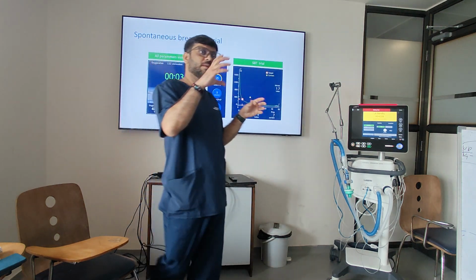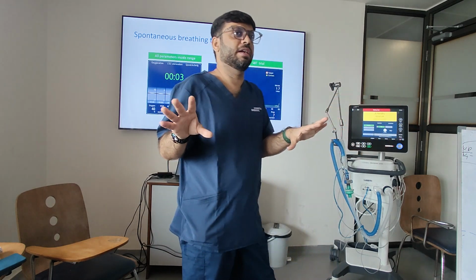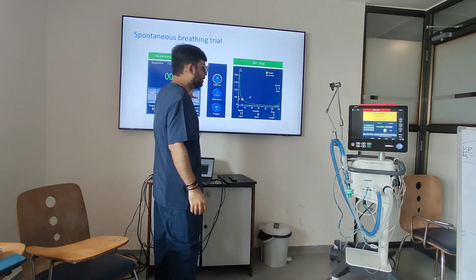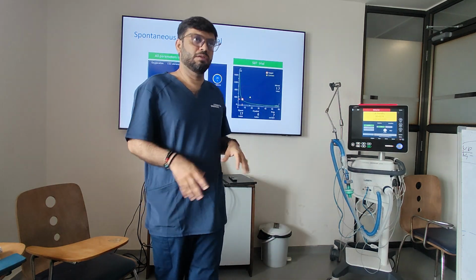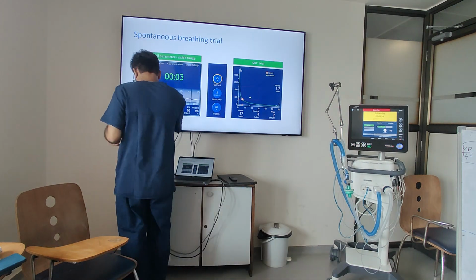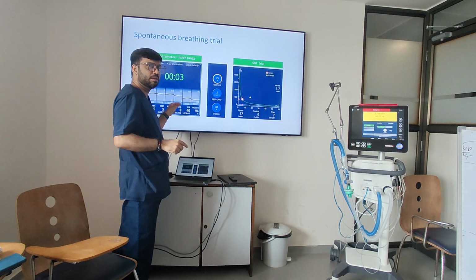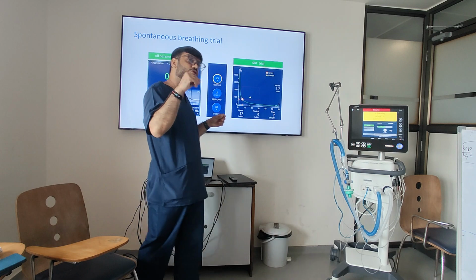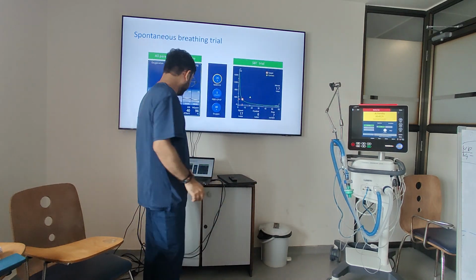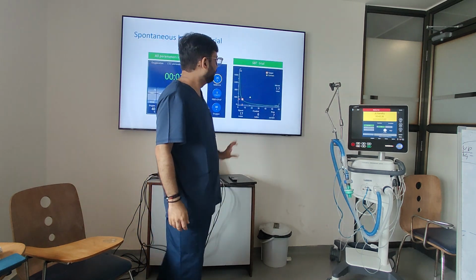So in your observation phase, it will remain 0, 0, 0. It will analyze for some time, for half an hour at least, and then it will go to your SBT part. If any parameter goes out, it will abort the SBT, and it will tell you which of the parameters went off by a screen on top. Each parameter will also have a separate timer, so you will understand how long that particular parameter remained. You can individually monitor each of those parameters. So you can actually say after so much time the patient got tired, so the parameter changed. We are done with here.